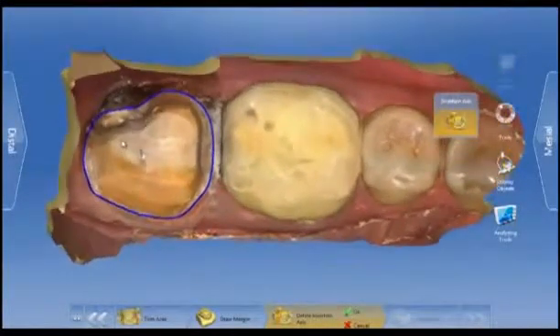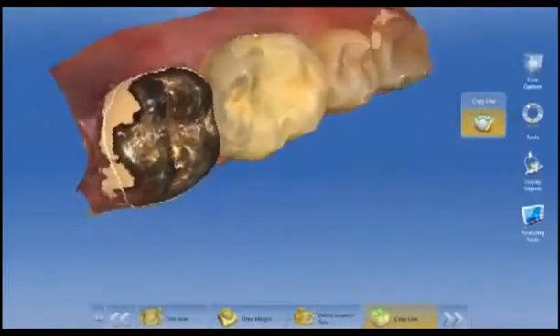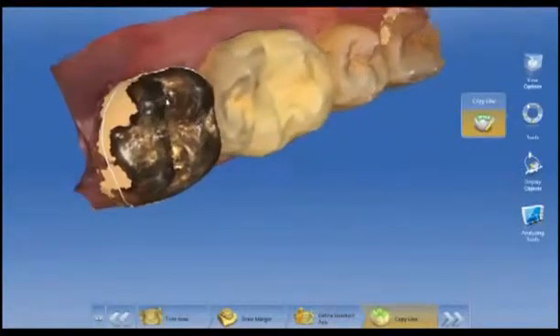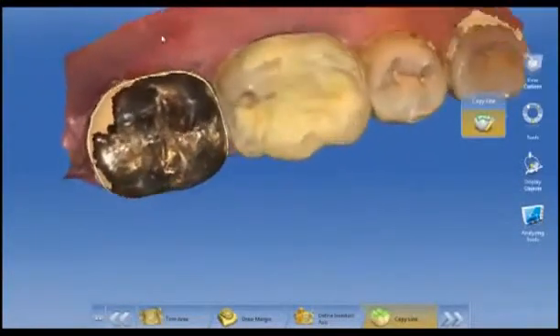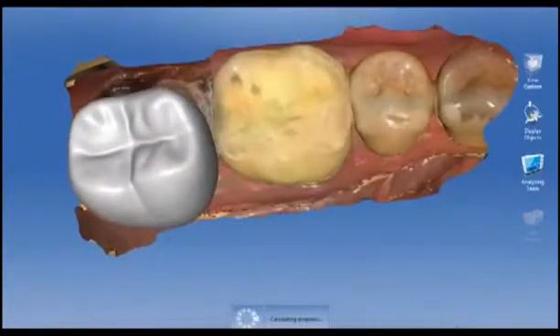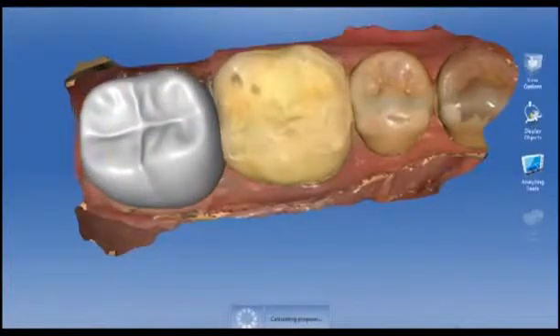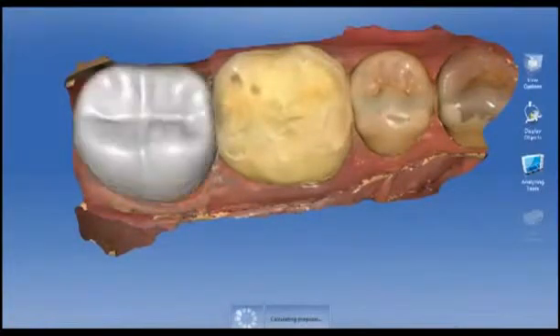The copy line is the area at which we're going to duplicate the gold crown. Now on the distal and the distal lingual, I didn't quite fill all that in, so that's the reason you see that more yellow model, but it's insignificant. I just wanted the occlusal surface covered, basically. CEREC will then calculate what the three-dimensional shape is for the proposal, but it uses the shape of the gold crown that was taken off for occlusion and the preoperative surface.